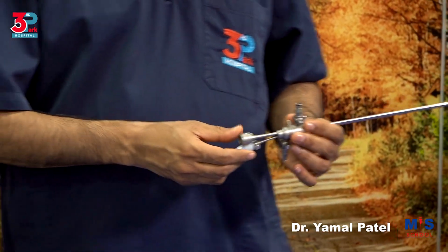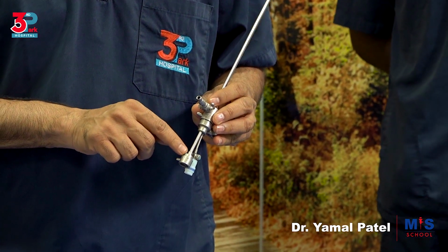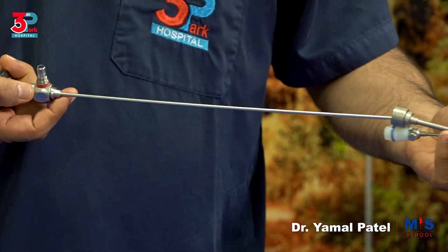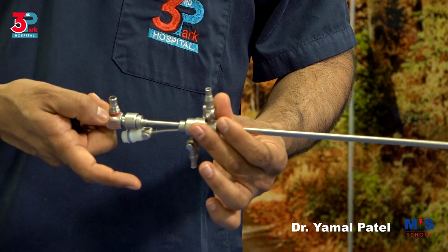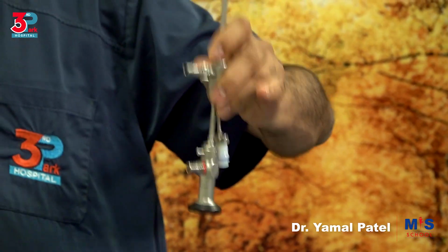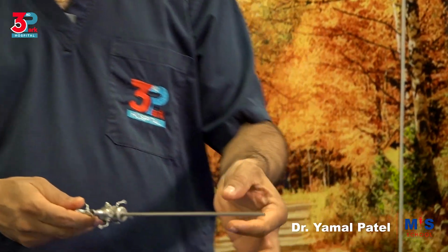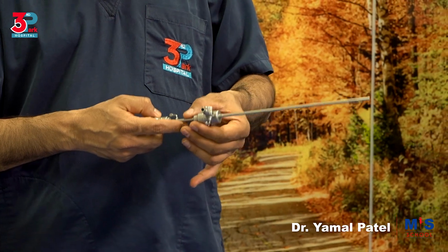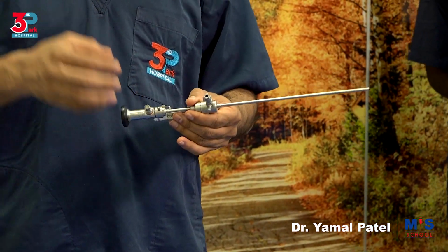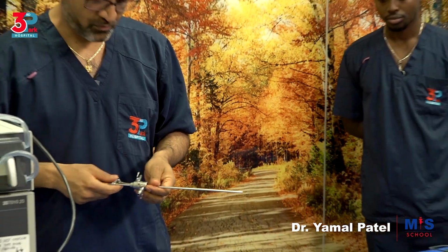When you do that, the next scope now goes in. So aligning these two, there are two lines and there is a 0 written here. So the two lines should be in line. Connect it and lock it. When you have locked it, then this becomes a ready hysteroscope for use. Until then, it's called outer sheath, inner sheath, telescope. Outer sheath, inner sheath, telescope, combined, assembled is a hysteroscope.